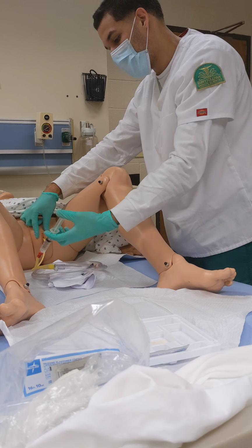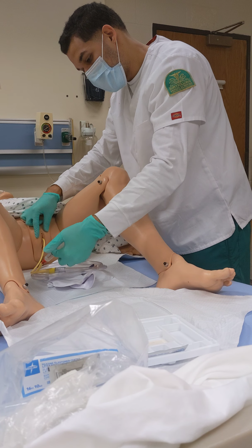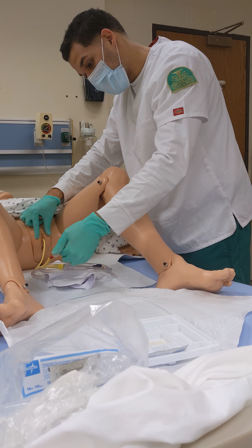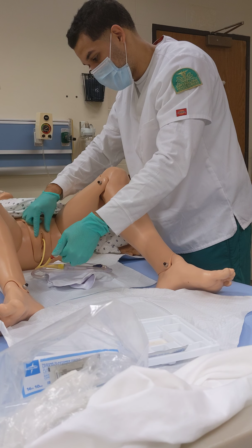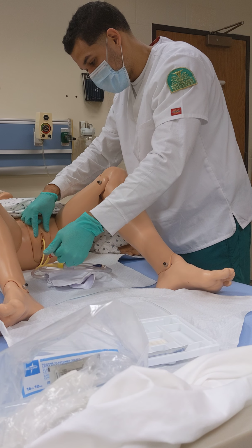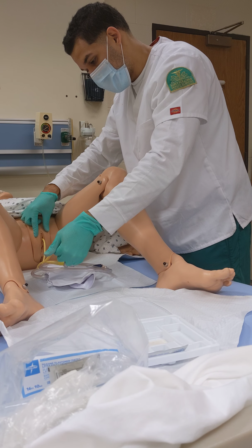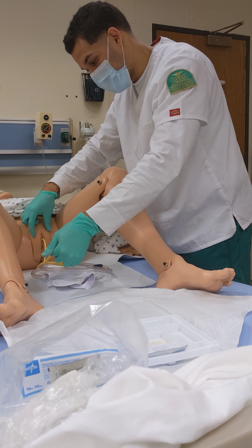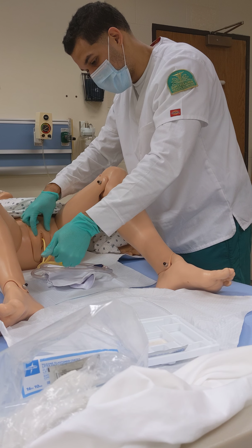I will then begin by inserting the saline solution, slowly, keeping an eye on the tubing on the catheter to make sure that it is not incorrectly inserted, so that it's not overfilling the main line with the saline and that it's getting into the balloon.